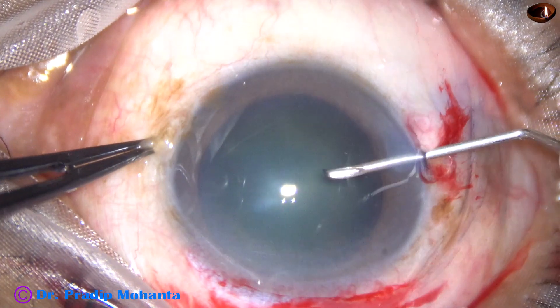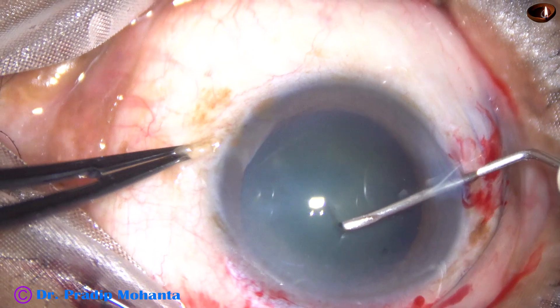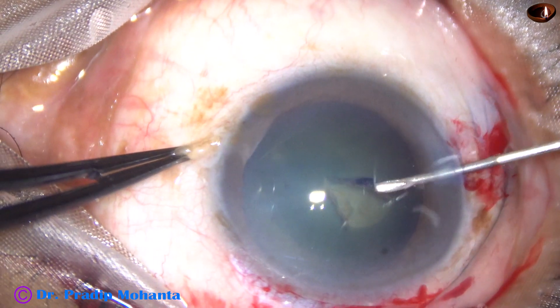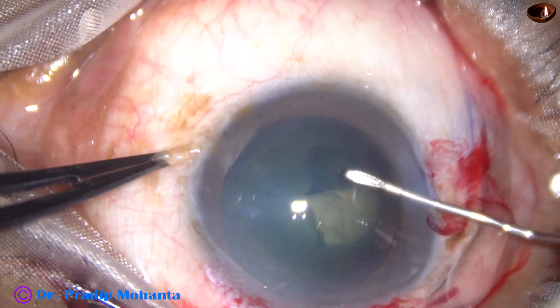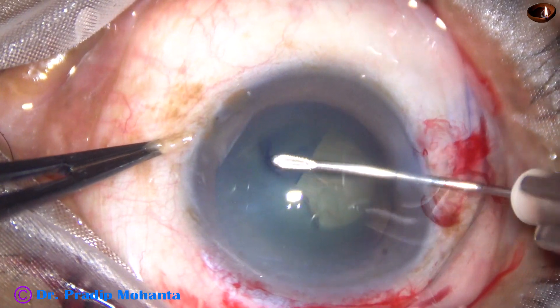This is how you do capsulorhexis with the needle. Raise a flap, flip the flap, and guide the flap.